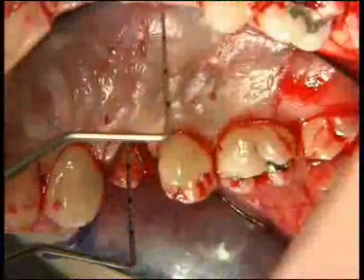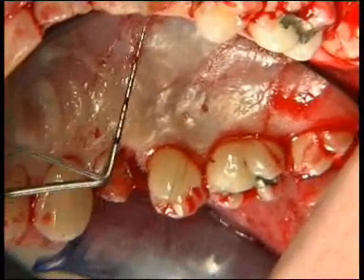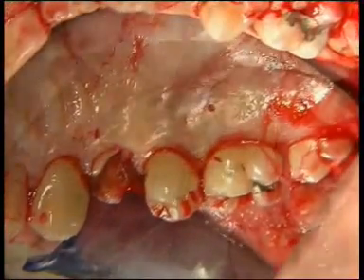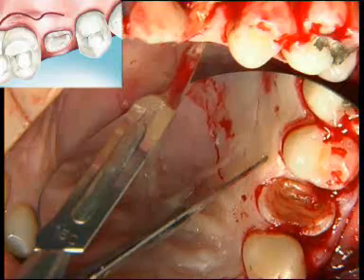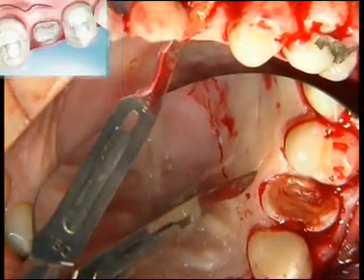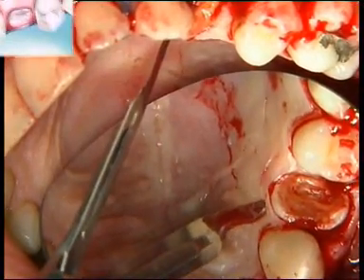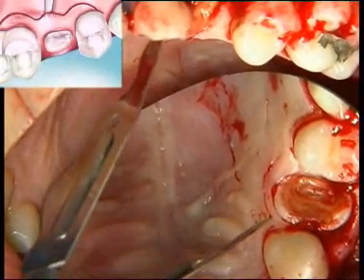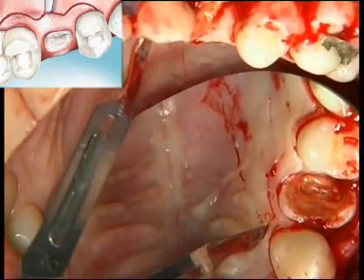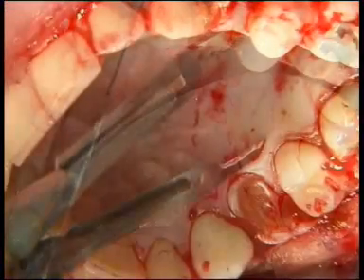After probing on the palatal side, a thinned palatal flap will be carried out with anticipation of the bone crest. This flap is designed using a 15C blade orientated perpendicularly to the long axis of the tooth. It starts with a paramargin incision in a more accentuated way in correspondence with the tooth in need of a dental prosthesis, then re-entering the intrasulcular site in correspondence with the mesial and distal extremity of the canine and second premolar respectively.